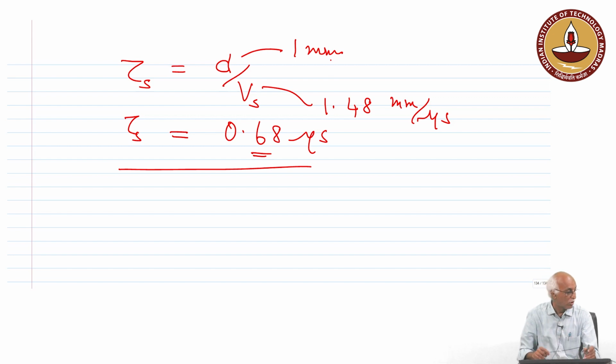If I allow heat to diffuse while the laser pulse is interacting, if the laser pulse is long enough, the heat will start diffusing. In that case, not only the temperature increase but the conductivity will also come into the picture. So that part has to be kept in mind.